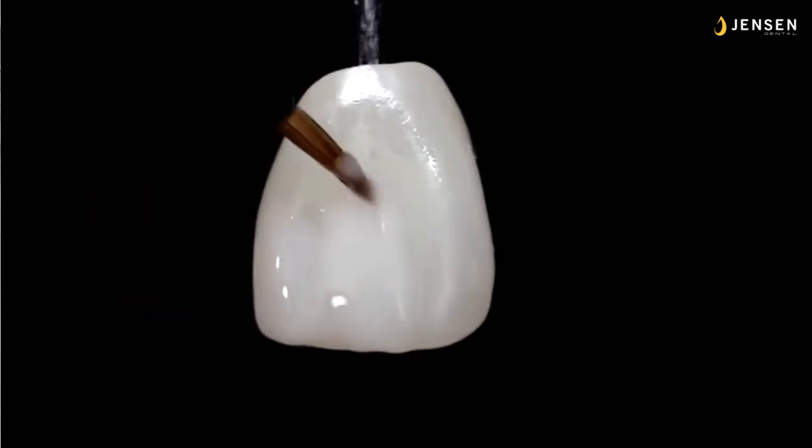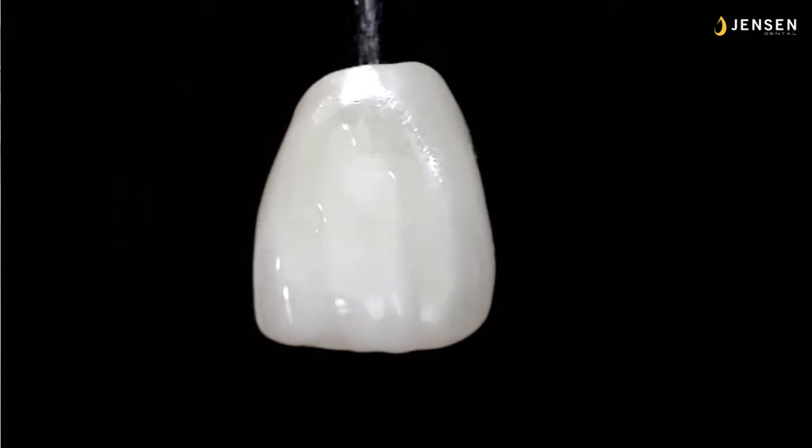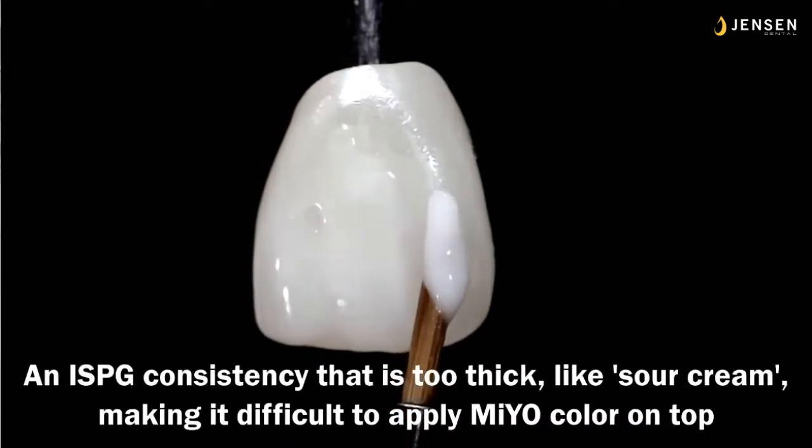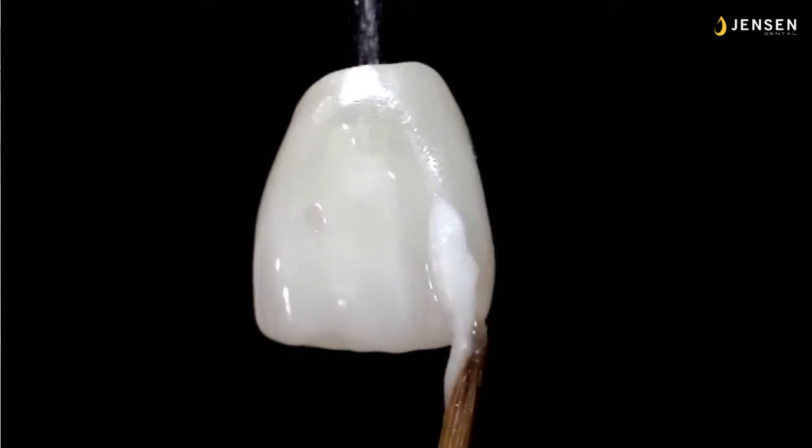So what I've done there in the middle is I've taken it from the jar and I've thinned it down maybe 5 or 6%, a good consistency to flow and adhere nicely. So with a brush that's the size of a 0 or a 1, think of the brush that's in a nail polish applicator. It works really great for the paste glaze. And if it's too thick like sour cream, it makes it really hard to apply the color. It's misery. I'm going to tell you right now. The hardest thing for me to learn was this, because I had no one to really show me.